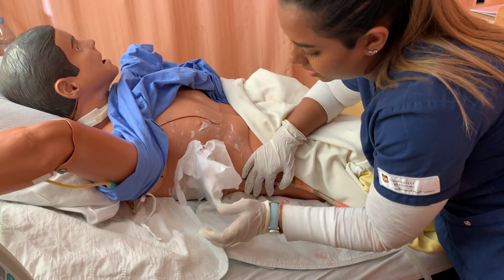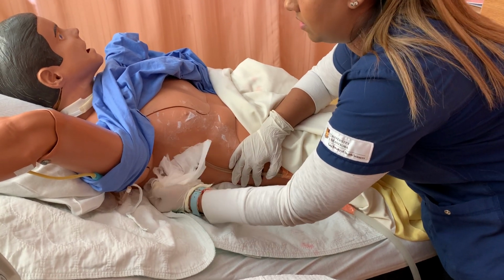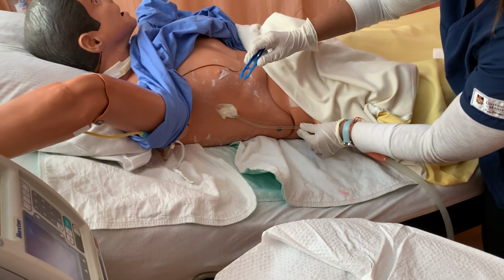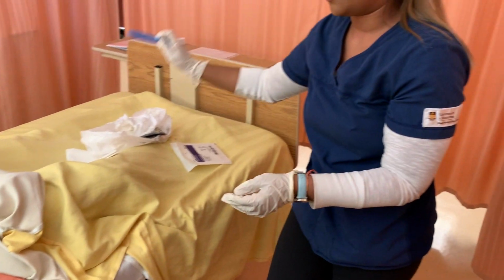There we go. There we go. And remove all that. Okay, so this is just garbage. I'm actually just gonna use my blue forceps here, stabilize the tube, take out this old Gelinette. That's also garbage, but trust me.